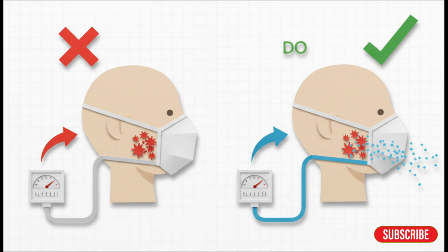Okay, now listen up because this is a huge safety point. With this mask, the flow rate absolutely must be at least 5 to 6 liters per minute. No exceptions. And you might be asking why. Well, it's to flush out all the CO2 they're exhaling. If you set it any lower, they're just going to be rebreathing their own carbon dioxide, and that's a big problem.